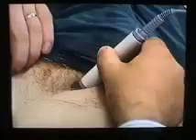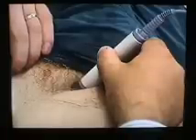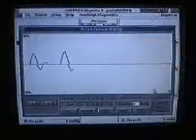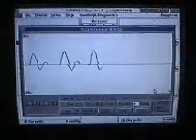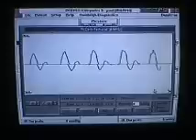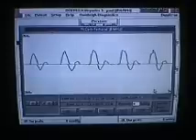A normal common femoral artery will typically produce a biphasic or triphasic signal: an initial systolic forward flow, a reverse flow phase, and a small forward flow phase before the next cardiac cycle.